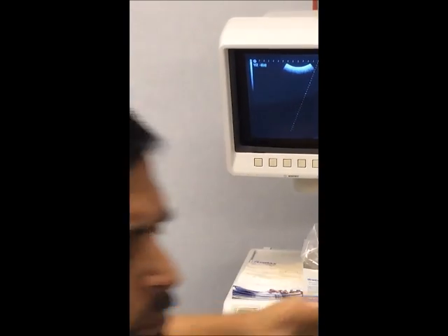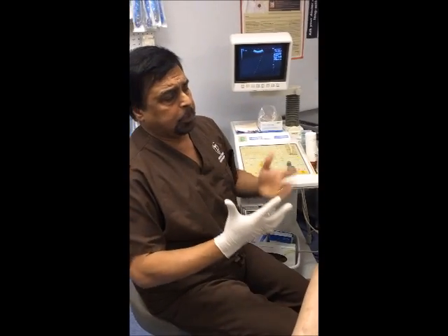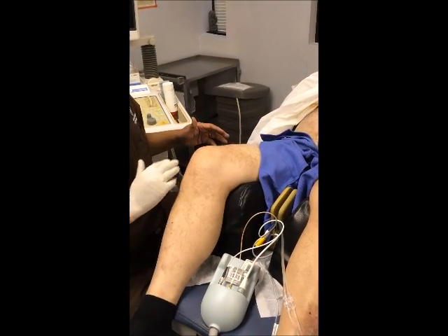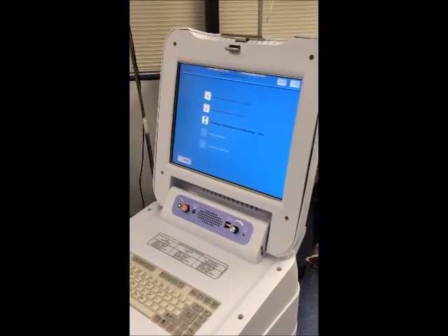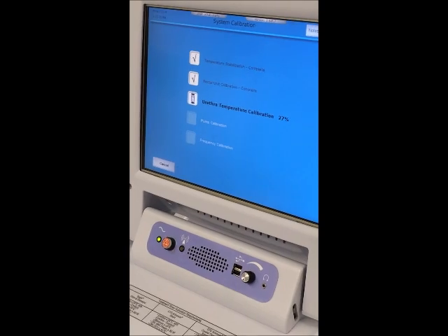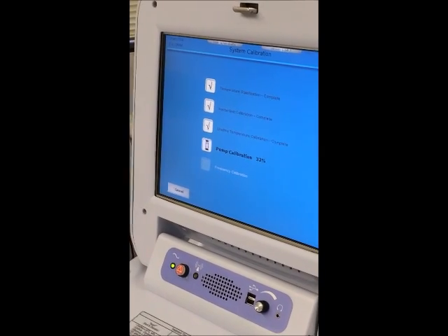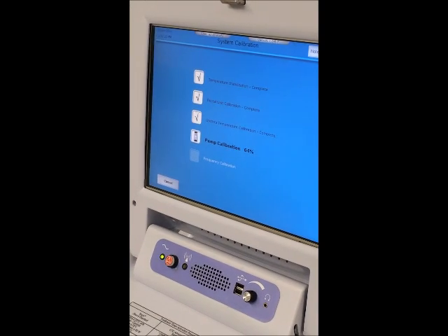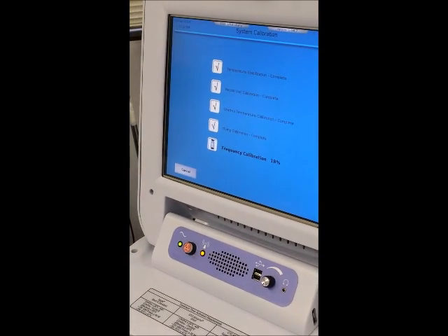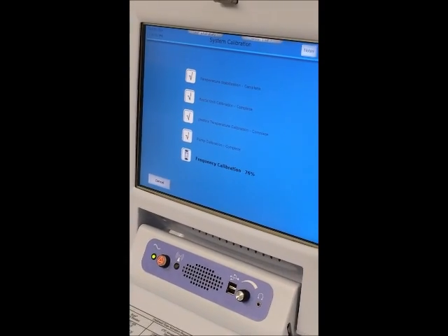From time to time I will check the position of the catheter to make sure it's in the right spot and the balloon has not moved. But since we have this vise grip, it grips the catheter so it doesn't move. The machine has already calibrated the rectal unit, the uniform temperature calibration, the pump calibration, and frequency calibration — so every time we turn it on, it self-calibrates.